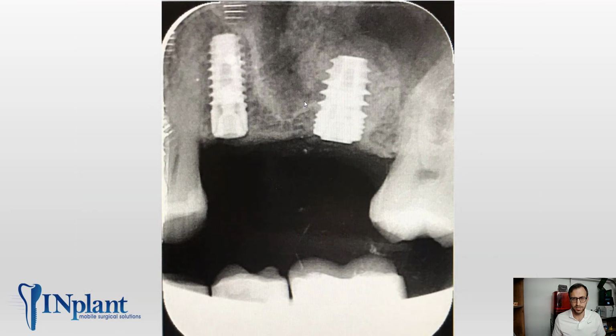And again, here we have a small tear, but the implant was still able to go in. And you see we're pretty well contained. And although we do have that tear on the mesial aspect, the superior mesial aspect, this implant will still work. And the kind of darker area here, that grayish area, is our PRF or collagen. This area will still be well contained.